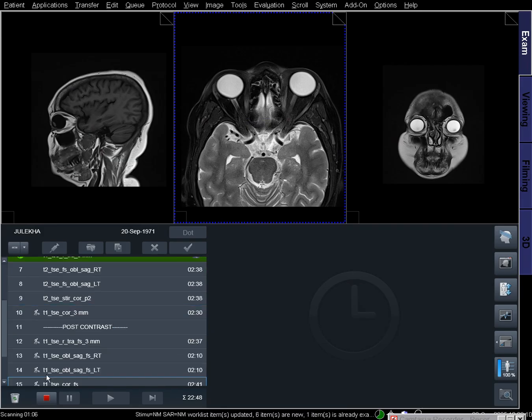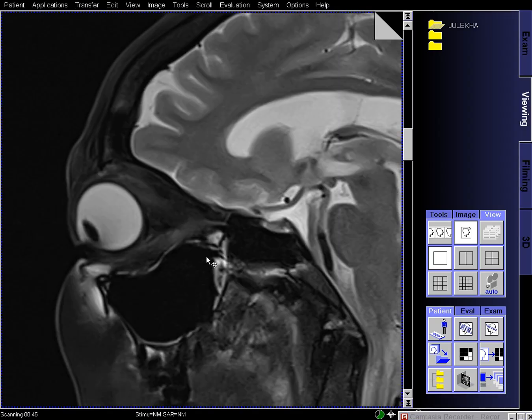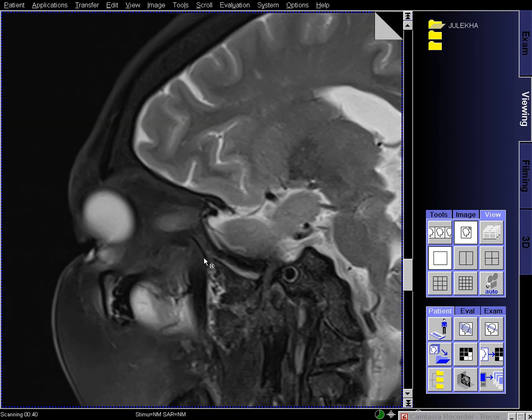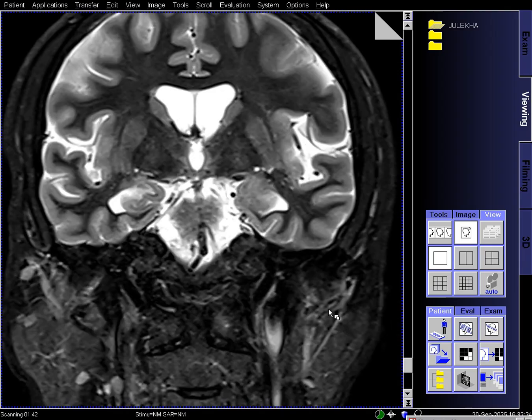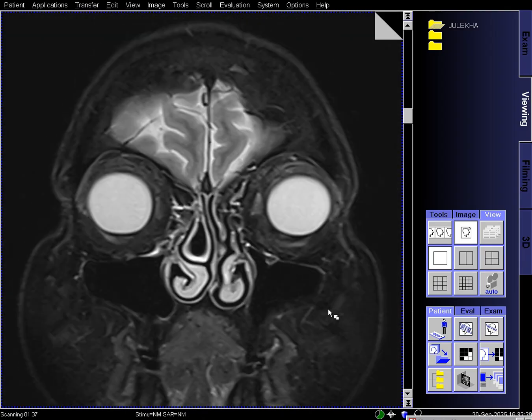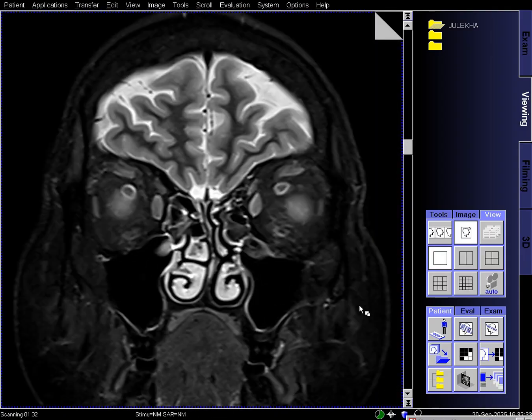Indications for MRI orbit scan. Visual loss that is clinically compatible with an intracranial pre- or post-chiasmal lesion, vascular lesions of the orbit, AV malformation, carotid cavernous fistula, orbital varix, history of visual disturbances, optic nerve sheath meningioma, tumors or suspected tumors, thyroid ophthalmopathy, extraocular myopathy, optic nerve neuritis, optic nerve glioma, unilateral proptosis, orbital abscess, inflammation.